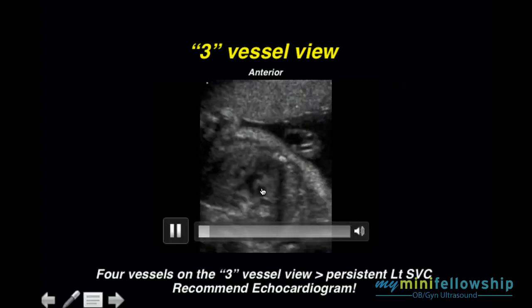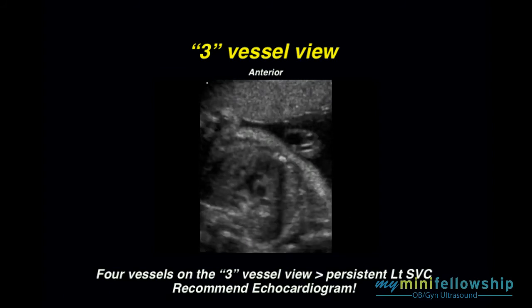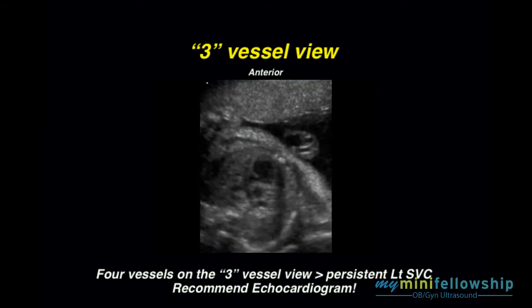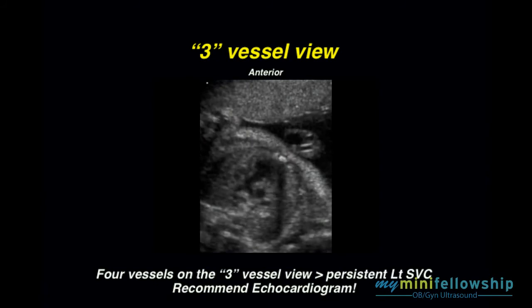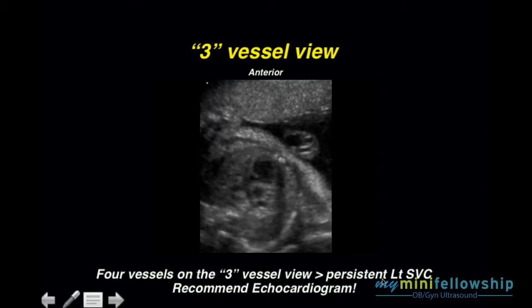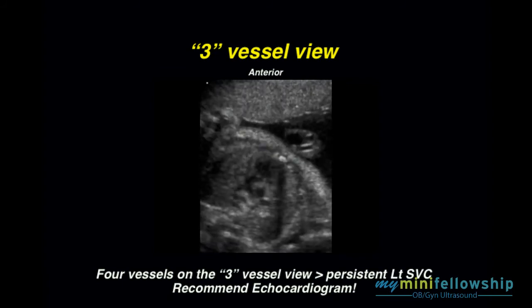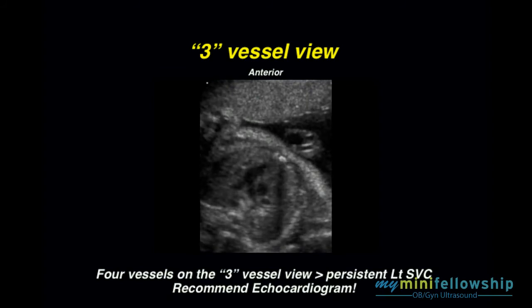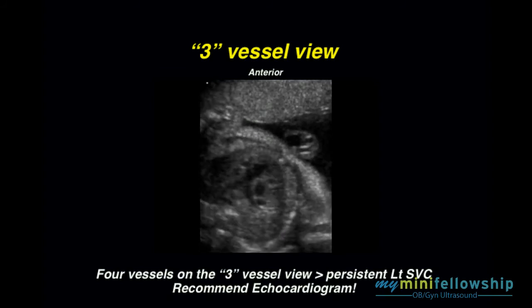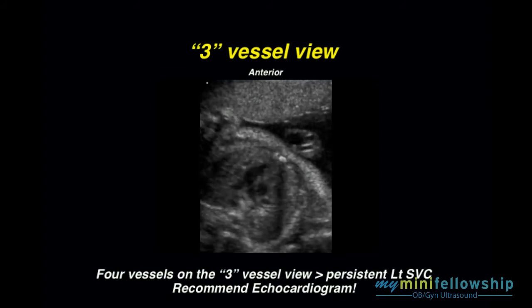Here I see four vessels on my three-vessel view. When you see four vessels on a three-vessel view, that means you're looking at a persistent left superior vena cava. That isn't always associated with a congenital heart lesion, but it's often enough that whenever you make that observation, you should recommend an echocardiogram.